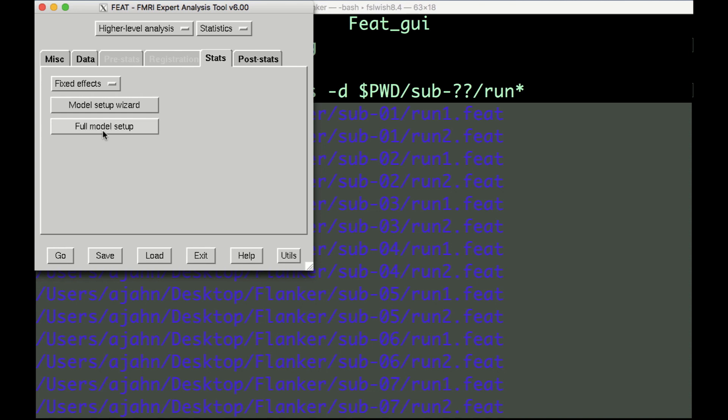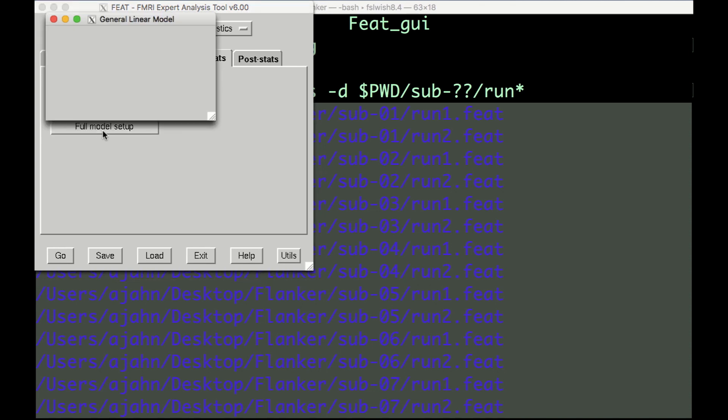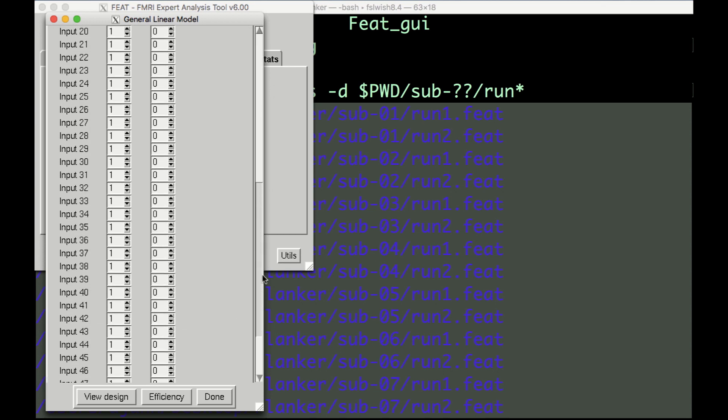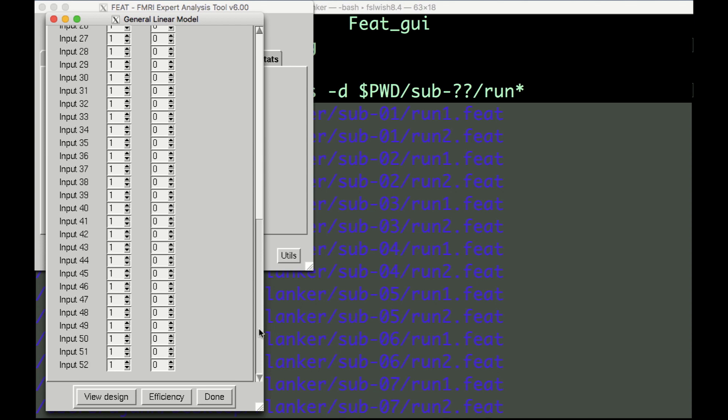Now click on Full Model Setup. This will open a window with the number of rows representing the number of individual contrast estimates, in our case, 52.